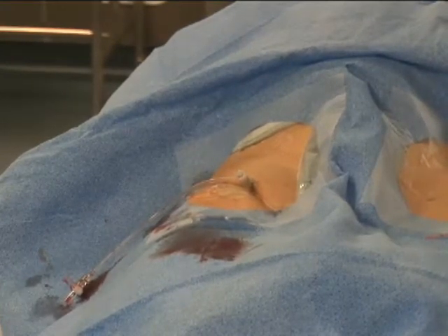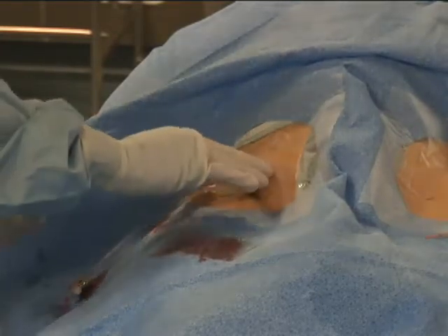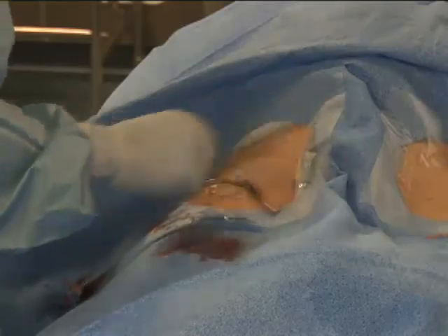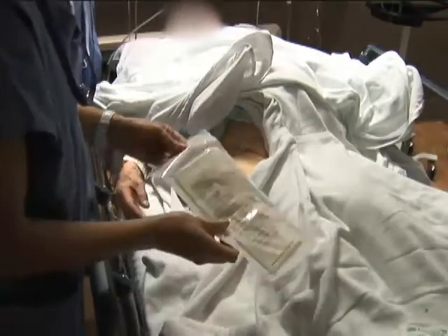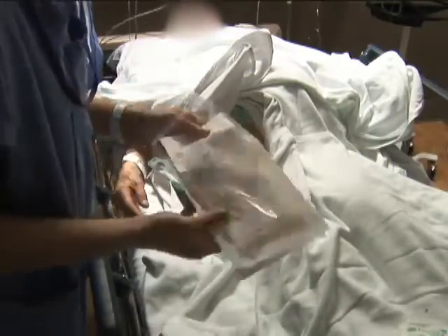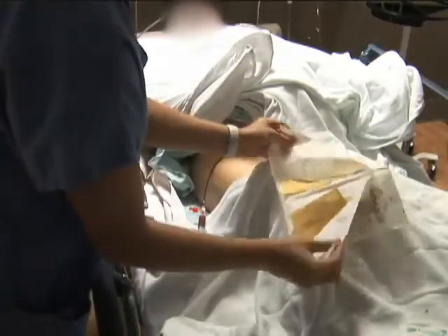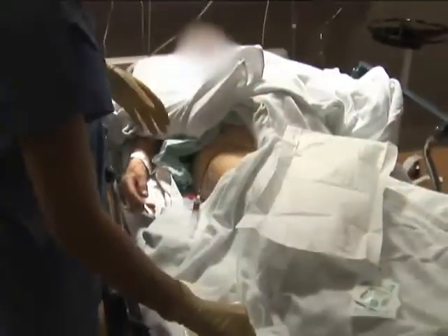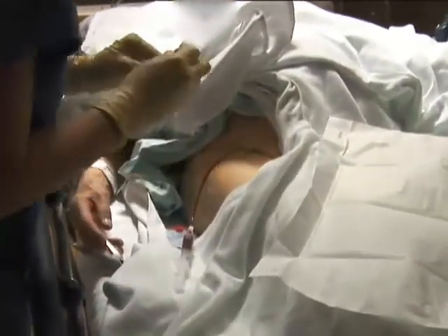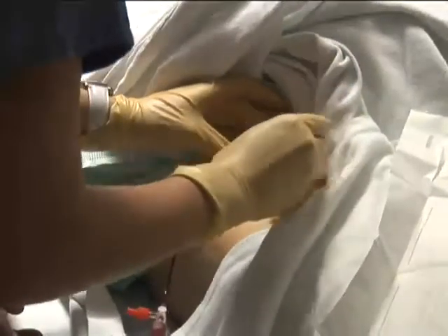Once the patient is felt safe for transfer, he or she is attached to a hemodynamic monitor and transported to the appropriate post-procedure recovery area. Typically, vascular sheaths are removed and hemostasis is achieved with manual compression. Although a variety of vascular closure devices are available for use, none have proven superior to manual compression with regard to preventing bleeding complications post-procedure. In this video, sheath removal with manual compression is demonstrated.